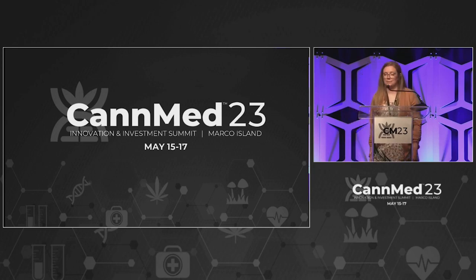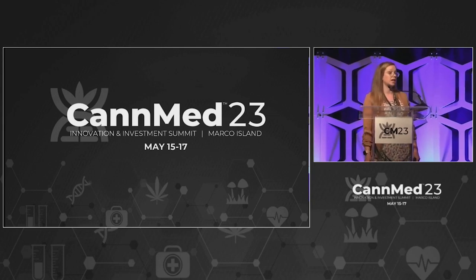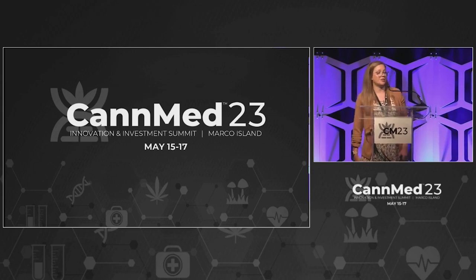Yes. Thank you. I'm sure that they're self-picking these samples, right? The companies are self-picking the sample, right? Yes. There's no state or third-party lab that's going, for final product, we do all of the sampling ourselves. So once the product has been irradiated, if it's being sent for final compliance testing, it is already in its package and we go out and randomly select. But for this experiment, they sent the sample. But yes, Florida is very strict about their sampling procedures.